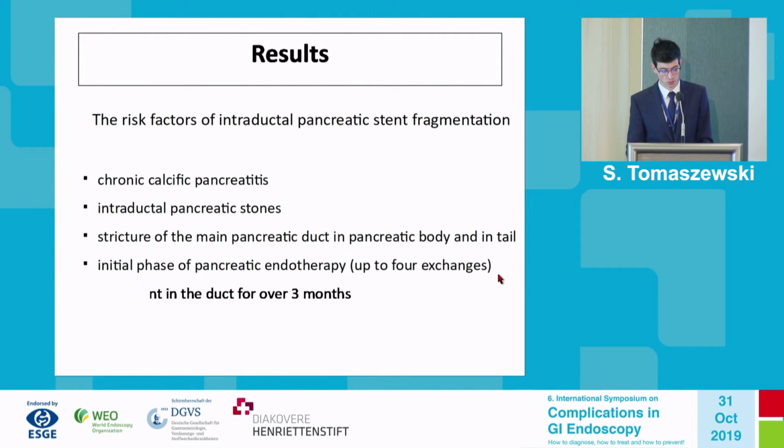I would like to also present the factors connected with pancreatic stent fragmentation.